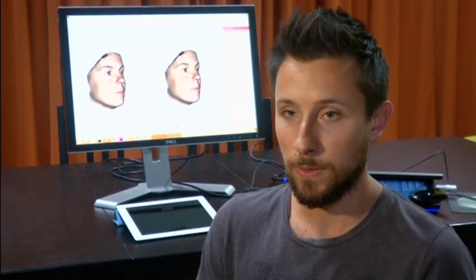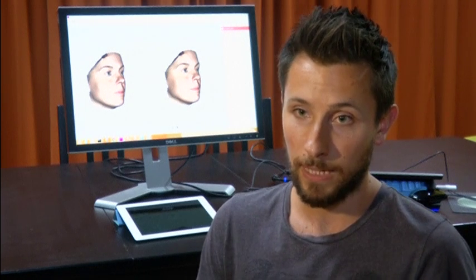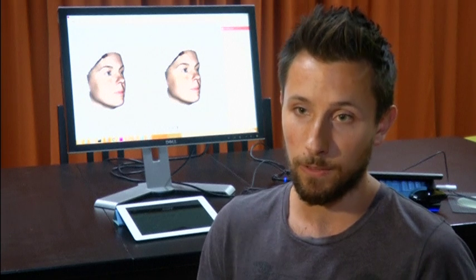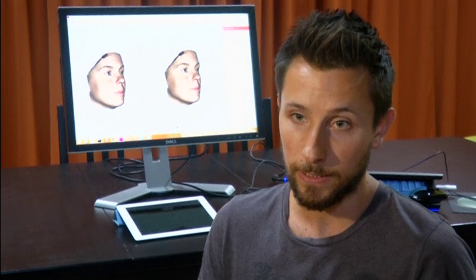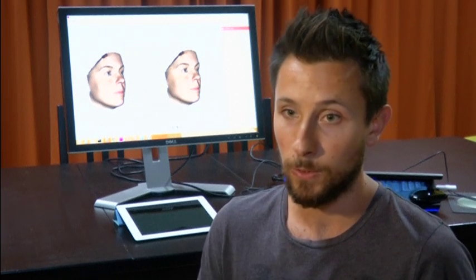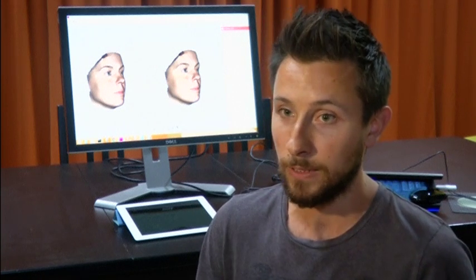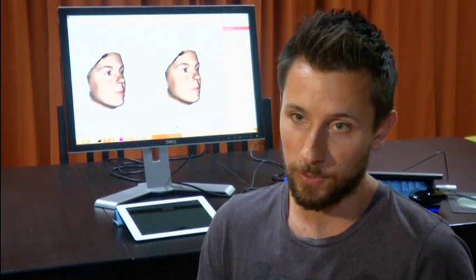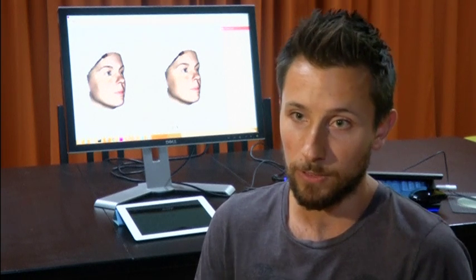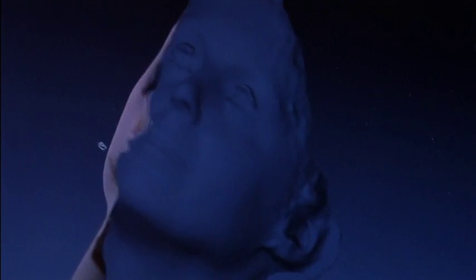We combined this with an algorithm that was based on faces that were scanned. A lot of faces were scanned, so that the algorithm could calculate what a realistic nose could look like. So in Photoshop you could very easily make a Pinocchio nose that's really unrealistic, but in this software we've managed to keep the boundaries to what's really realistic. Yeah, and still you can tell that there's something odd about it. Yeah, it's a bit uncanny actually.